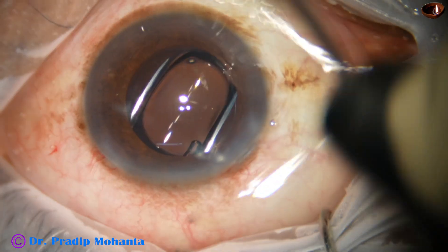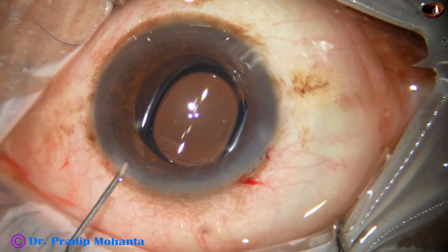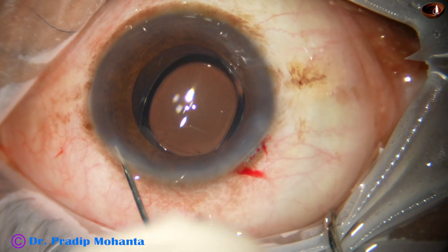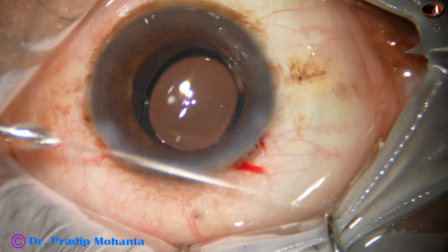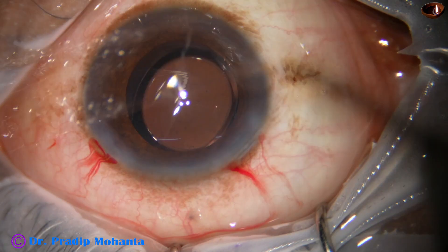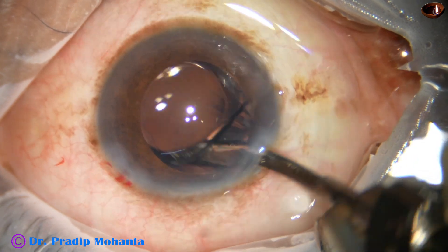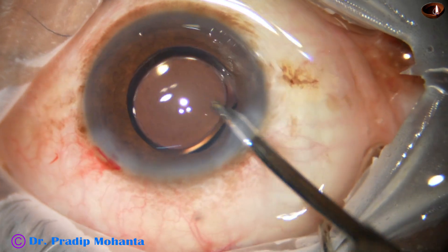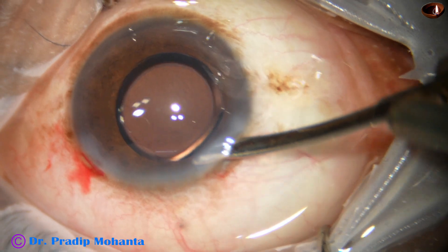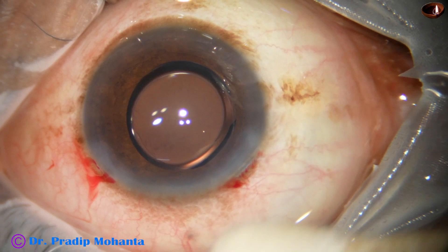The intraocular lens has gone into the capsular bag. Now a bit of moxifloxacin is injected and the side port is closed by hydration of the corneal stroma. A final lavage of the anterior chamber is done with BSS and Simcoe cannula. All the viscoelastic that sticks to the corneal endothelium is removed, the anterior chamber is nicely formed, integrity of the wounds is checked and the case is concluded.